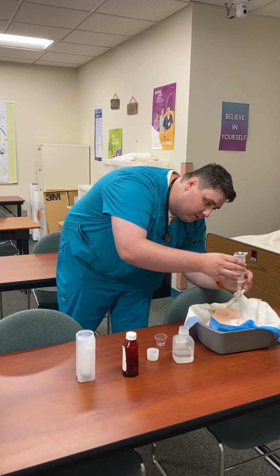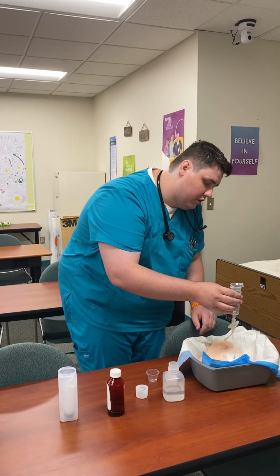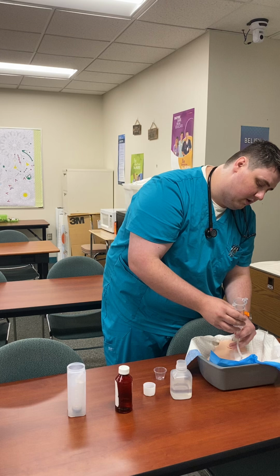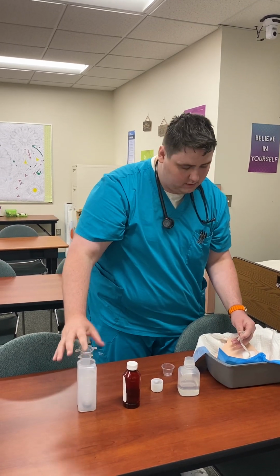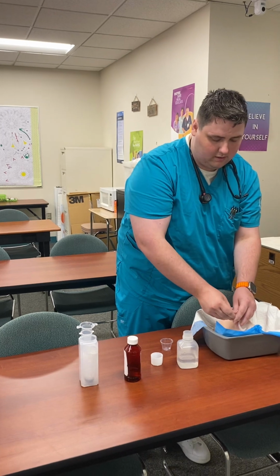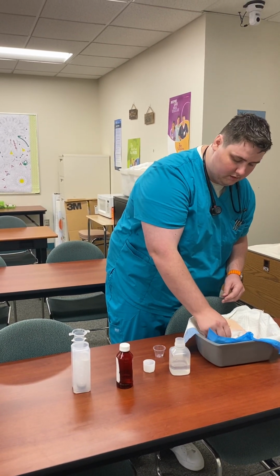So you let this completely drain through by gravity, upon which you are able to clamp, remove your syringe, cap it, and ensure that your patient has a sterile, clean environment before moving on.